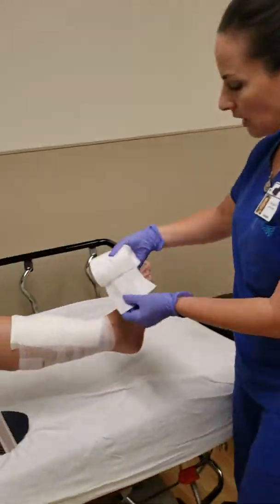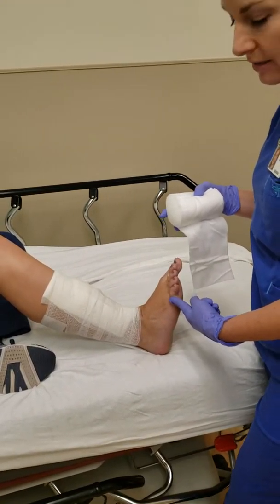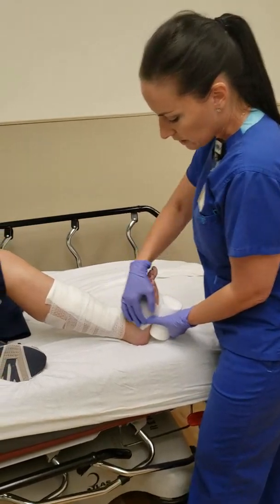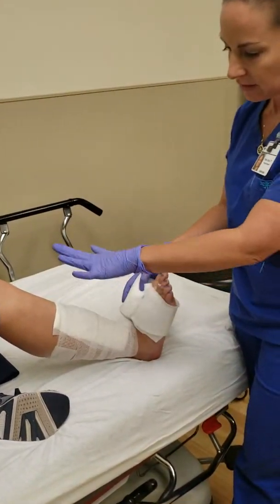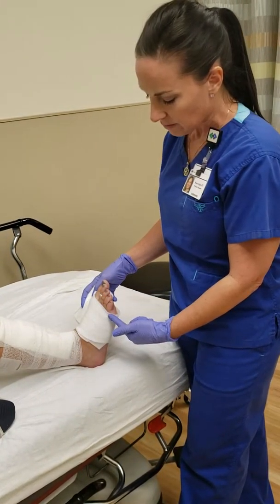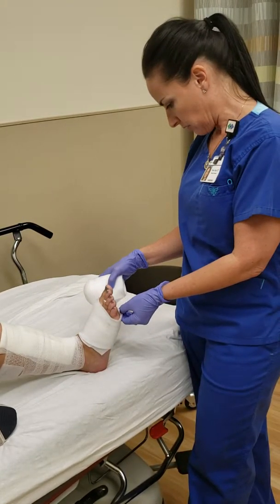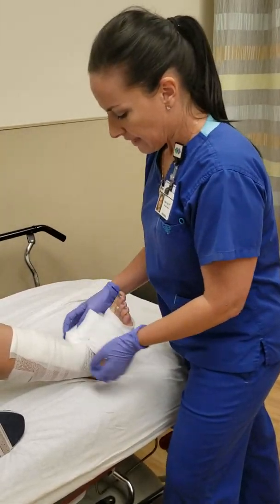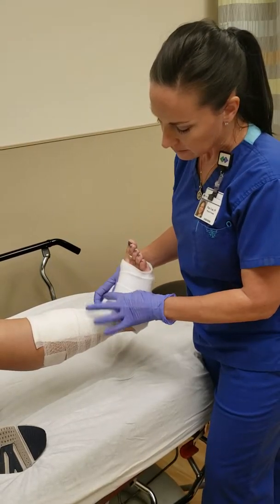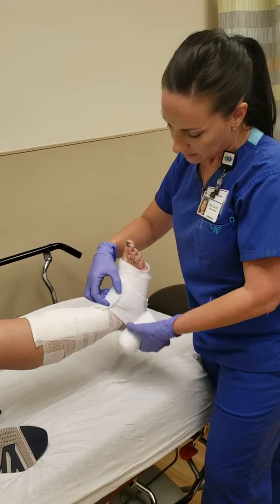We're going to take the first cotton layer. Go ahead and rest your heel — just toes up. Whenever you wrap, you want to make sure the patient is in either neutral or slight dorsiflexion. This first cotton layer is just meant to pad the skin from all the other layers that are about to go on. Make sure that you go over the metatarsal heads both dorsally and plantarly. I'm going to scoot this down, then lift to make sure I catch the heel. The tendons stick out, so I'll do a couple of pleats.